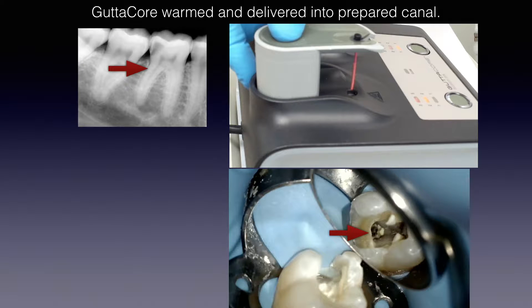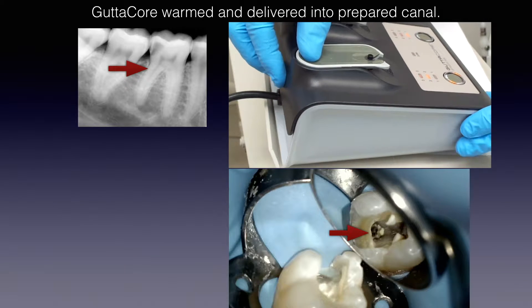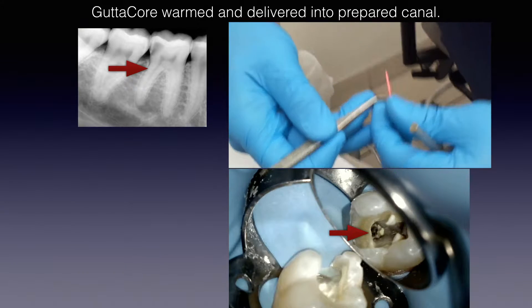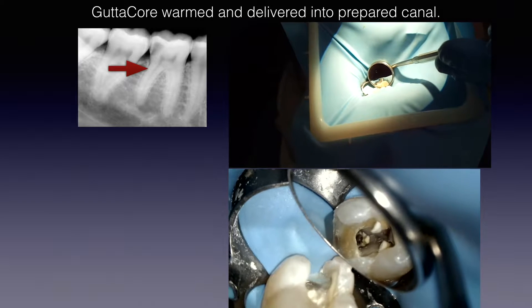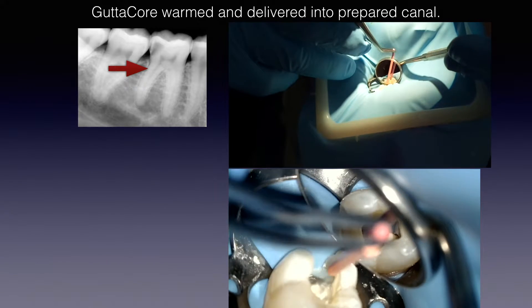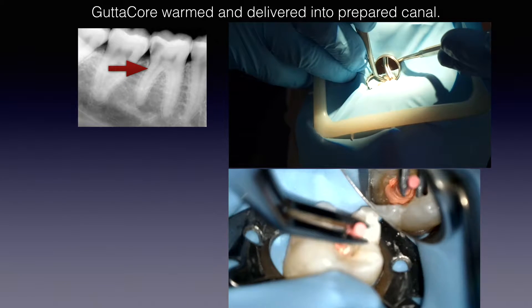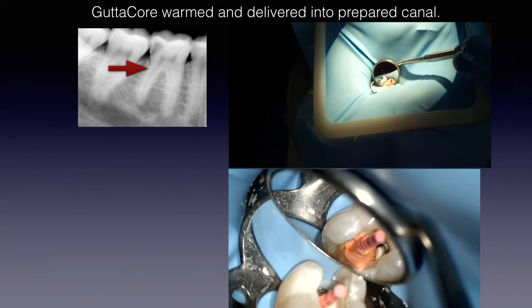It takes about 15 seconds or so — just enough time to make sure clinically that everything's in order around you. When the light on the top right side starts to blink, that means it's warm enough and we're ready. Now we take out the obturator, grab it with the cotton plier, and I'm looking at the marker — the built-in ruler — that's where I know where to break it off. You see the speed within which I take the obturator from the oven to the tooth. I'm counting to about seven or eight seconds and we're done.